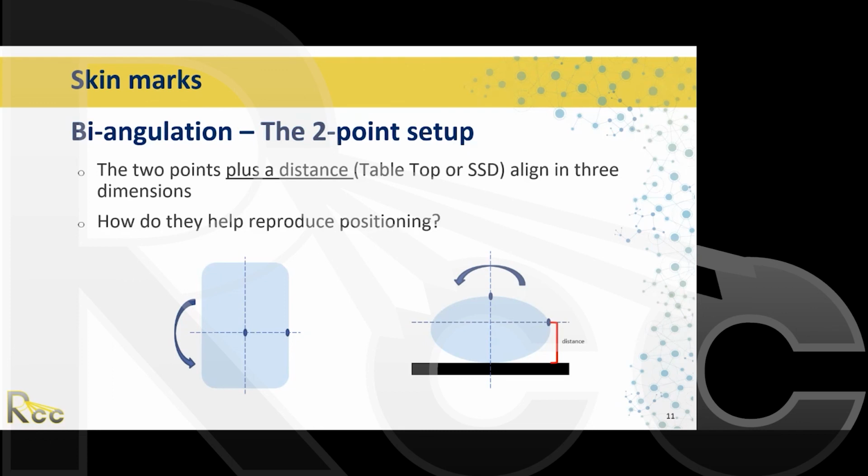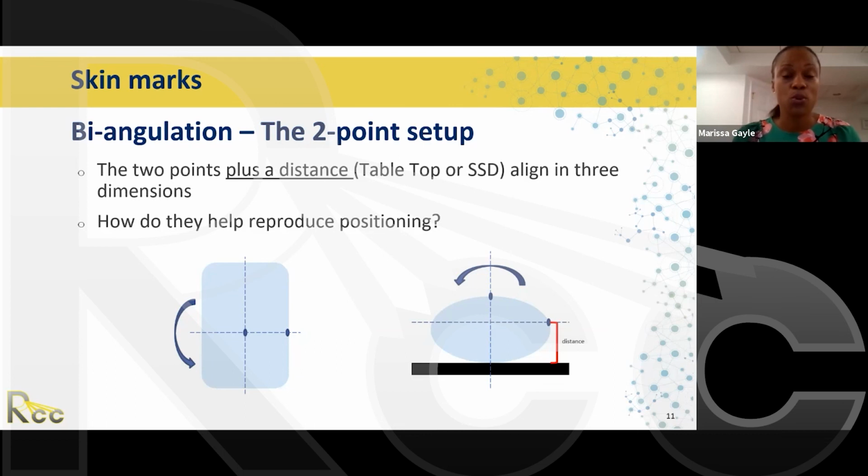Fantastic. Oh, and we have another question that came in. In the case of a patient who has a tumor of the cavum that grows and pushes the ocula out of the orbit, how can you make a head and neck mask for such a patient to minimize pain? What we have done is we'll put a little wet gauze over that eye that is protruding. We will make the mask, let it harden, cut out where that eye is, let it harden, take the mask off, cut it out, put the mask back on, and then continue with the scan.